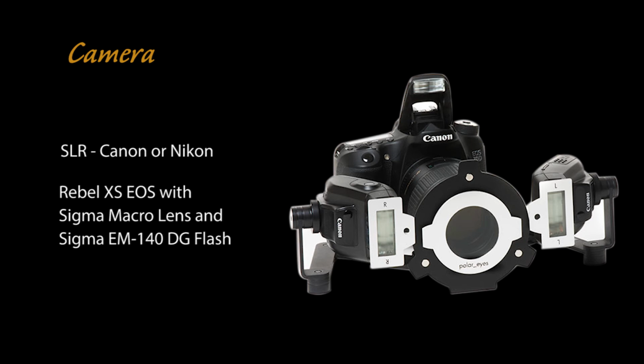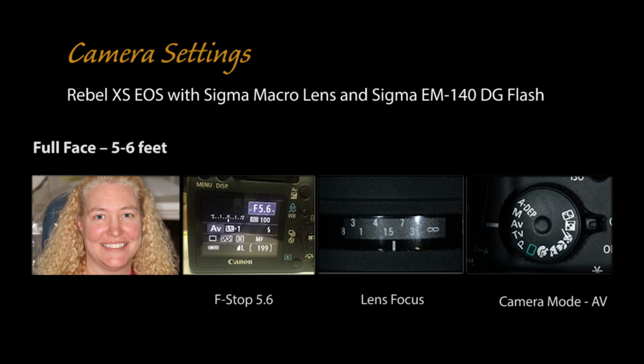Now we're going to reference where you can buy these types of cameras in a few more slides. But at this point, I'd like to reference the picture that we want to take. Now, this is a great picture to give to the laboratory. That is a picture of my lovely wife, Mindy. She's referencing here as a model for us. That picture basically shows, from the top of the head to the bottom of the chin, a full face picture. Now, what does this picture really make relevant to the laboratory? Well, it really helps us understand the shape of the face. So let's, for instance, talk about a denture case.